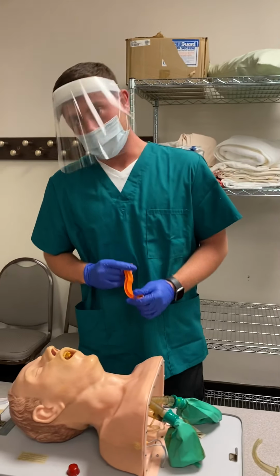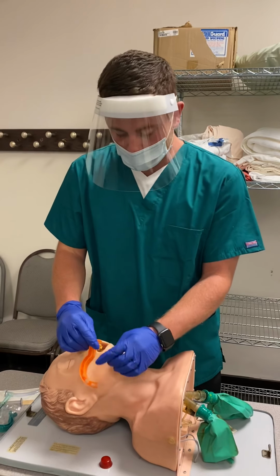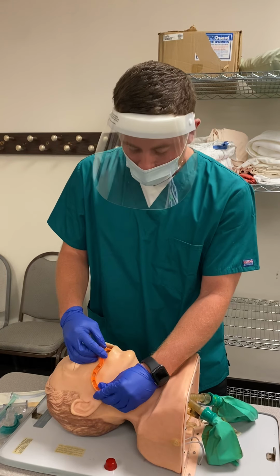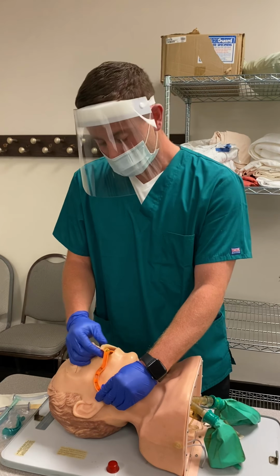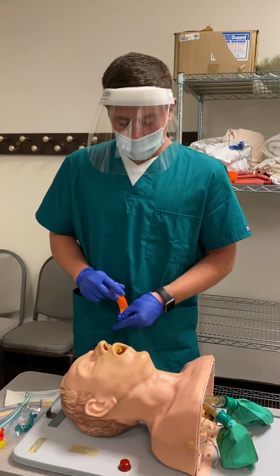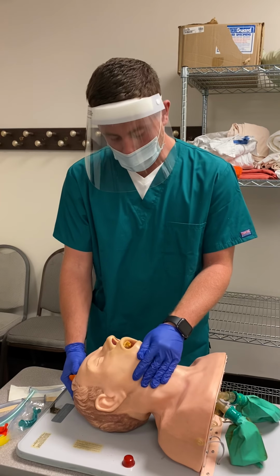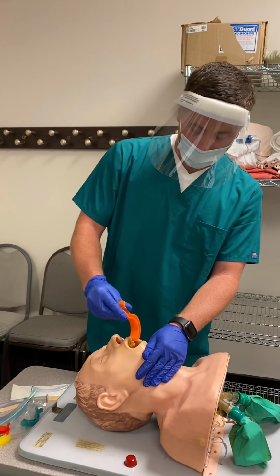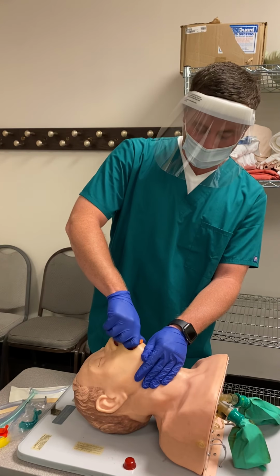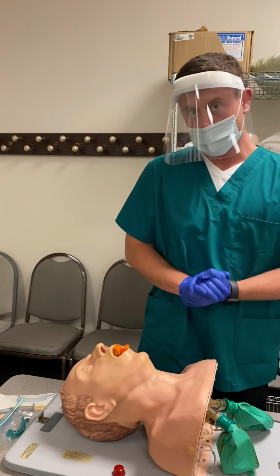Next, I will measure the oropharyngeal airway at the corner of the mouth to the corner of the jaw, just so the flange sticks out. Next, as I insert it, I will position his head, insert it sideways, and rotate it to where the tongue is now out of the way and the airway is secure.